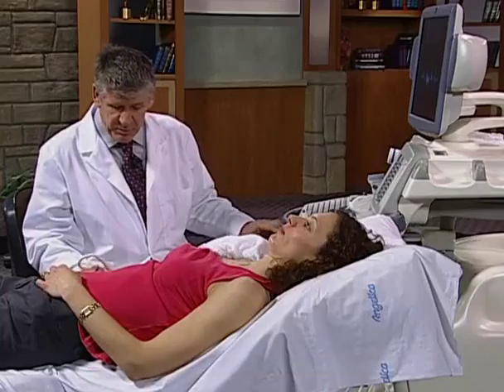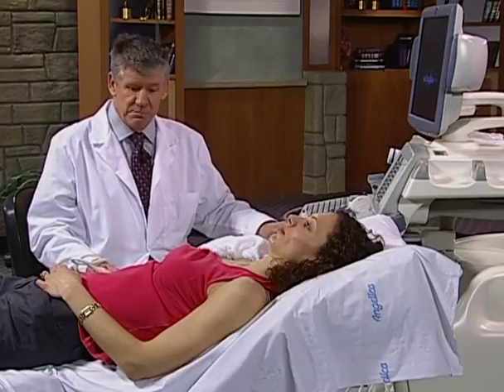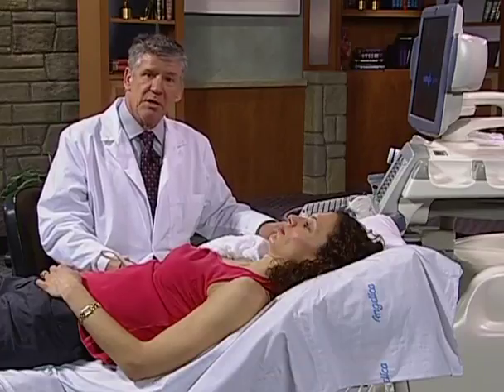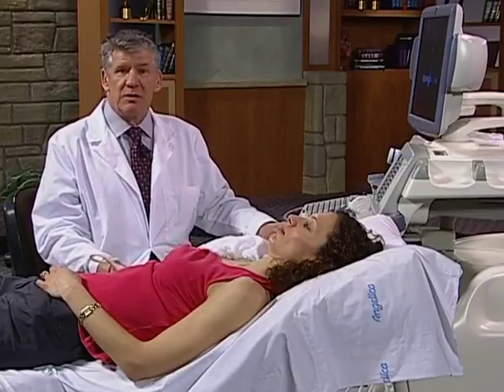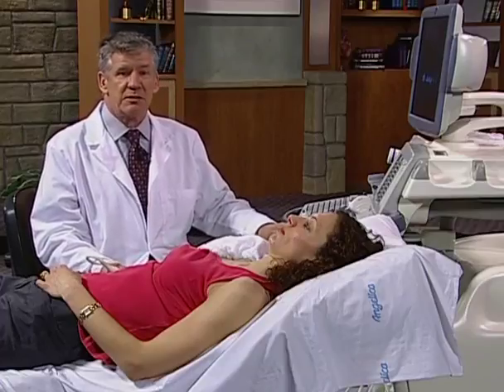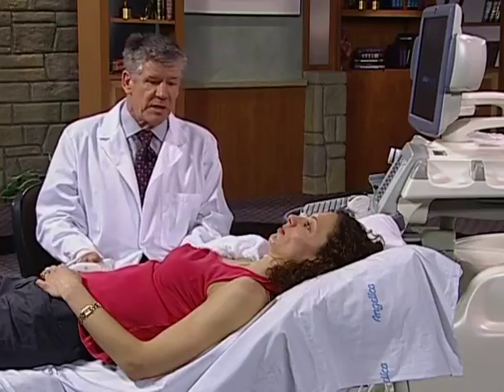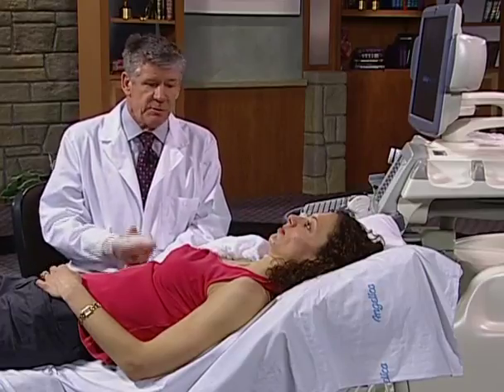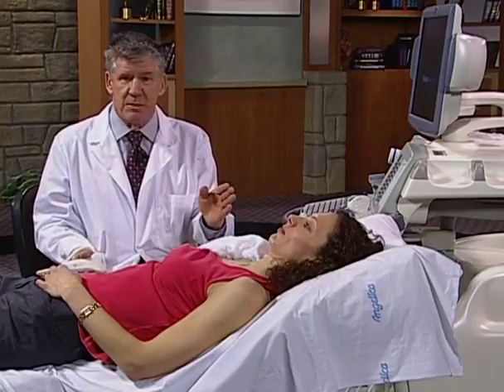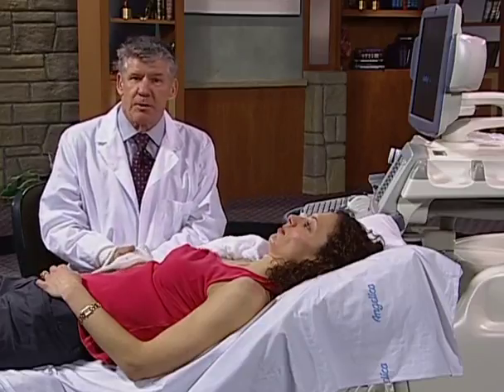So that would complete our examination. If we were considering, as I mentioned, a bypass graft, we would measure the radial artery diameter from the origin to the mid portion to the distal radial artery to make sure it's of sufficient size for a coronary artery bypass. So what we've accomplished here in just a few minutes of the demonstration is to show the innominate, the subclavian, the axillary, and the vessels in the arm.